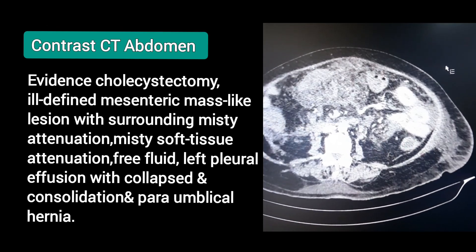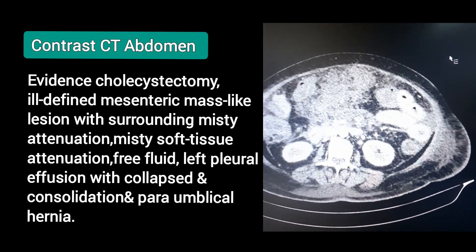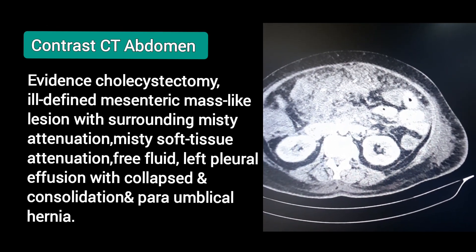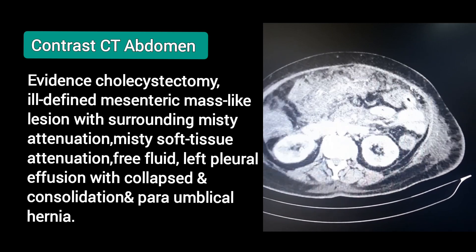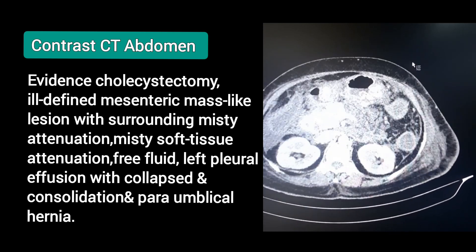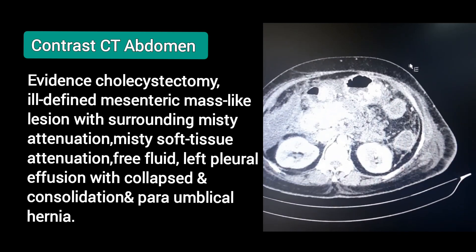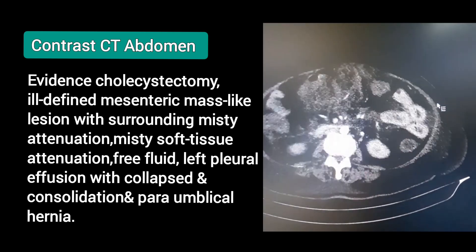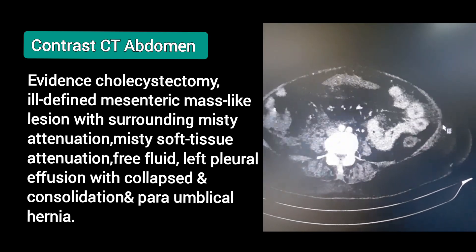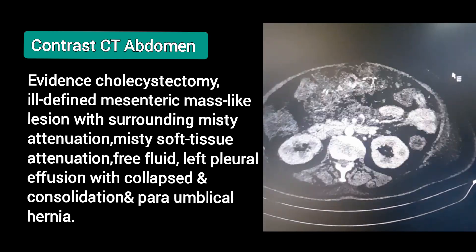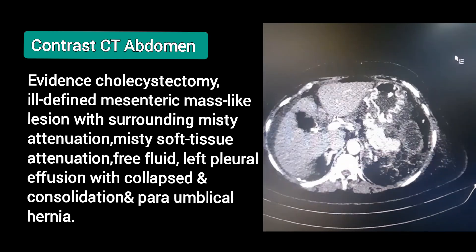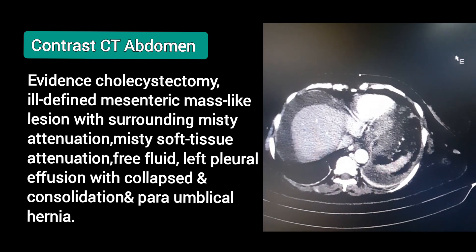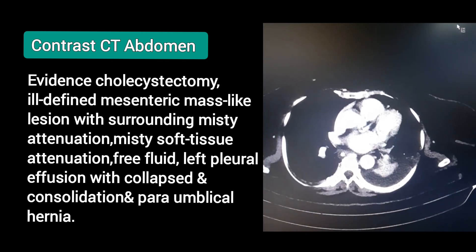Contrast CT abdomen shows evidence of cholecystectomy, an ill-defined mesenteric mass-like lesion with surrounding misty attenuation, misty soft tissue attenuation, free fluid, left pleural effusion with collapse and consolidation, and a para-umbilical hernia.